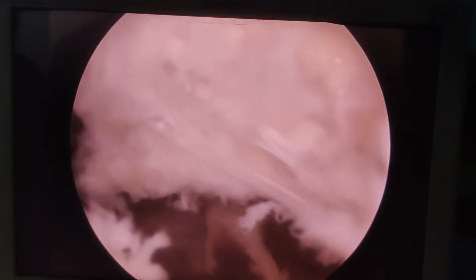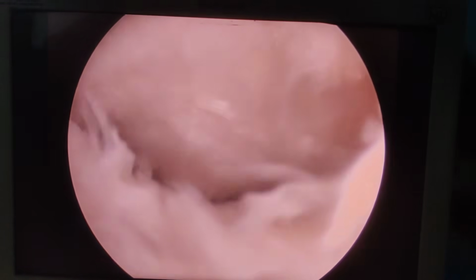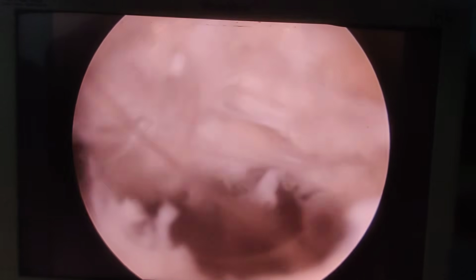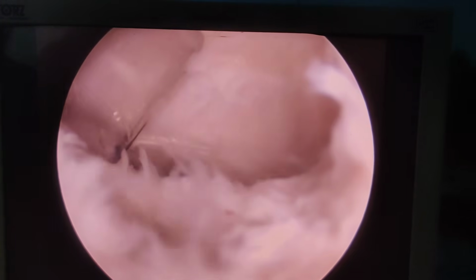Just a second. So this is the posterior medial portal. This is the back of the tibia. Just let me withdraw it. This is the edge of the tibia, so we are falling back off the tibia. So now I think I have done enough. The next step will be to pass our tibial jig and try to make our tibial drill hole.